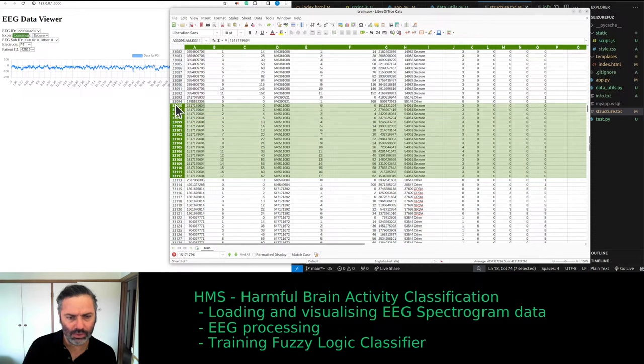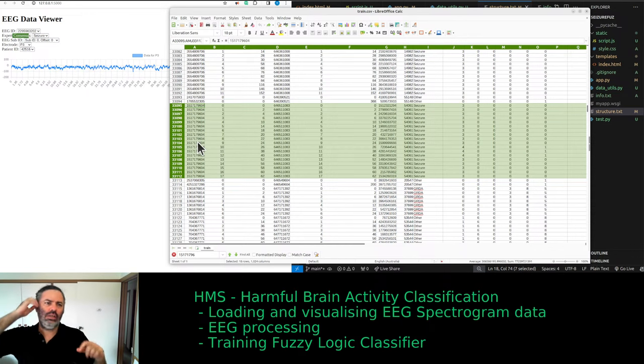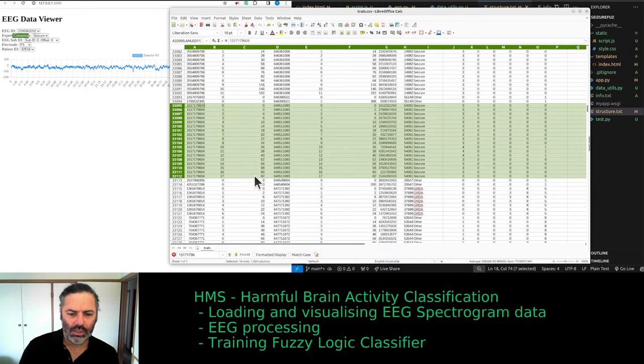This one here, for example, I understand the rationale behind it. So this is all the same data segment. If you look at the raw file, you just have, was it 50 plus 62, whatever it is. But then you have a lot of duplicates of the same thing. In reality, you could have had a 0 to 50 and then, if you need some overlap of 10 seconds, 40 to 90, and that will cover it all. So instead of these 18 entries, it's really just 2. Hopefully it's clear what I'm trying to say.